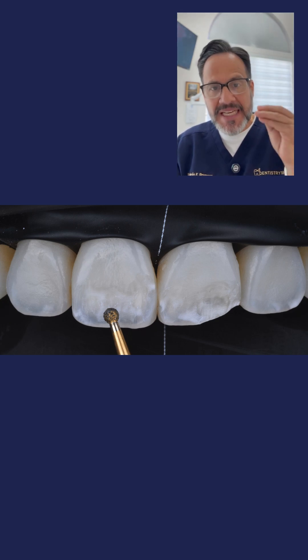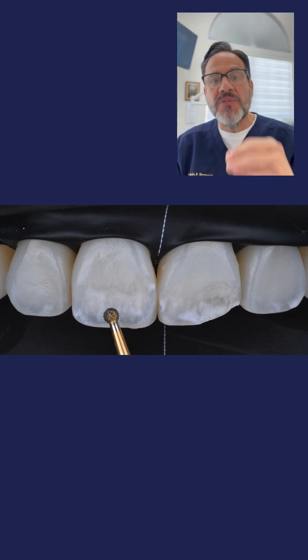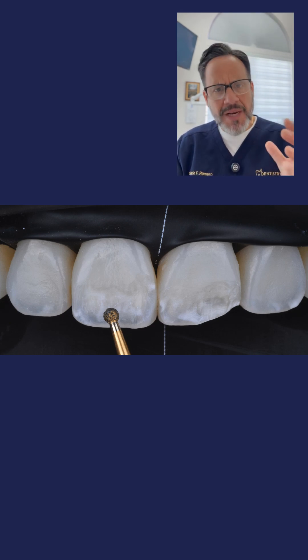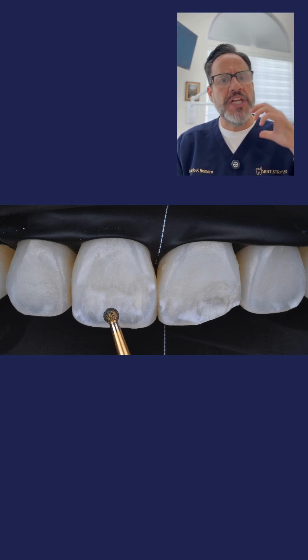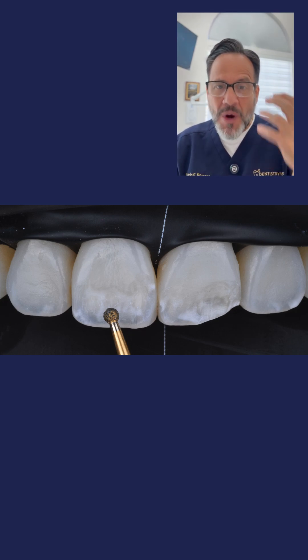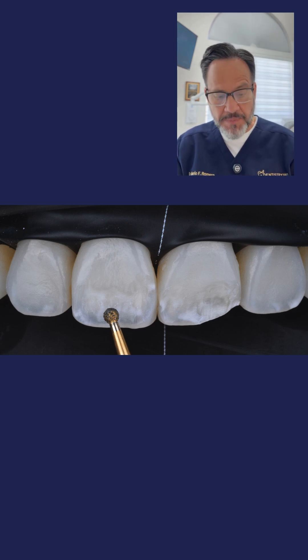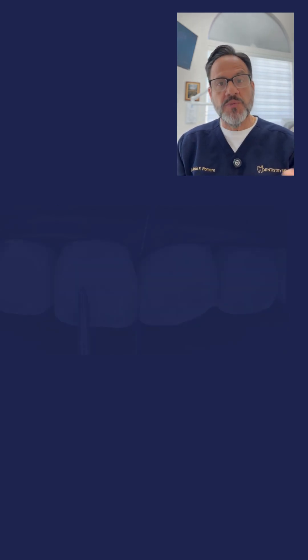For macroabrasion, you need to use a diamond bur. What you're seeing here is we're literally cutting out the white spot using this bur. You want to be as conservative as possible — just remove enough enamel with the white spot so that you can then layer some composite and hide it. On photo number six, we're using a different type of bur to smooth out everything we've cut down.